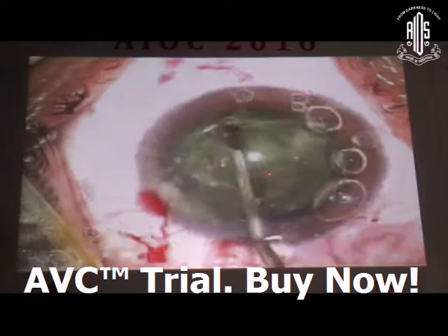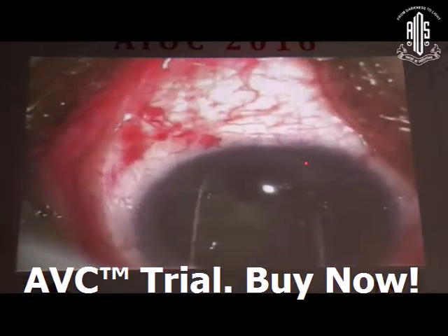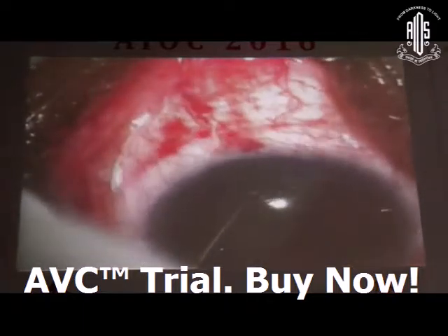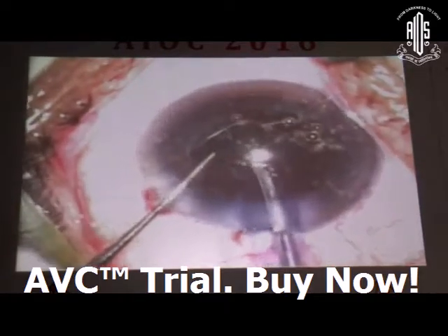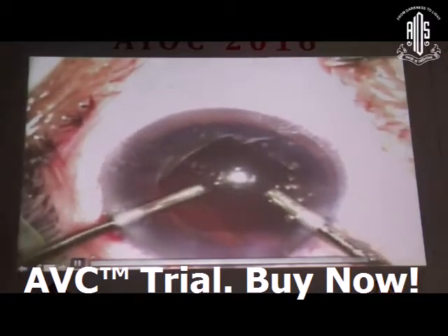Can you see? And with viscoelastic, we have just broken it, and you don't really need to do anything but just aspirate it out. So could you see this particular thing, that in a softer cataract you can actually viscodissect the nucleus and you can remove and disassemble the nucleus in softer cataracts.